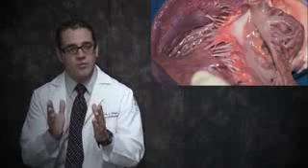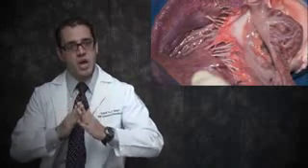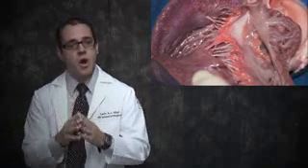Valves control the blood flow in your heart. They open and shut to allow blood to flow between your heart chambers and into your arteries. Your doctor can also use cardiac catheterization to measure blood flow and oxygen levels in different parts of your heart. He or she can also check how well a man-made heart valve is working and how well your heart is pumping blood.